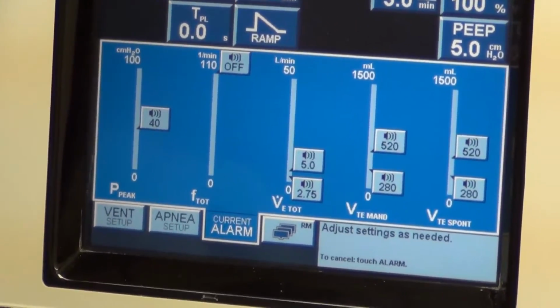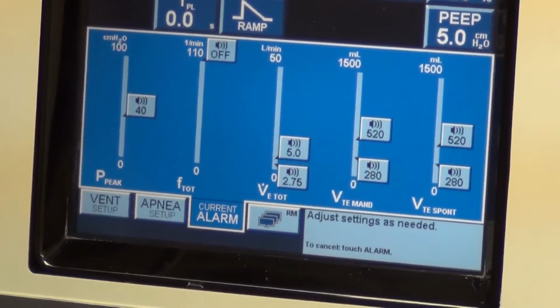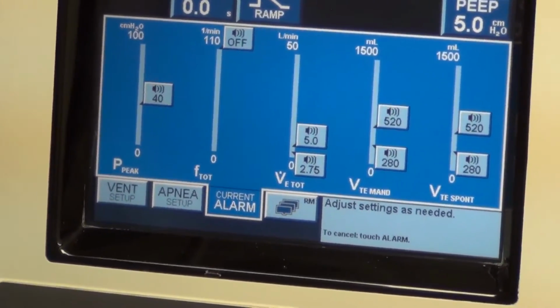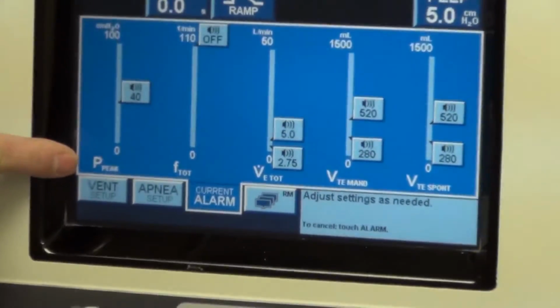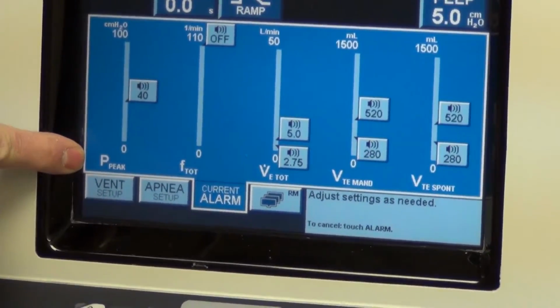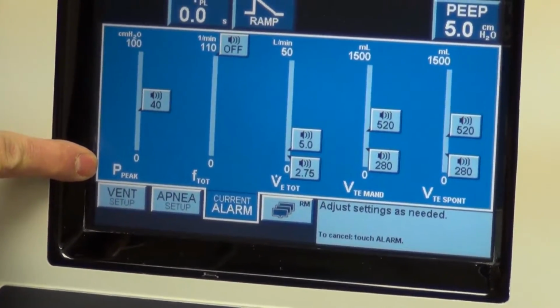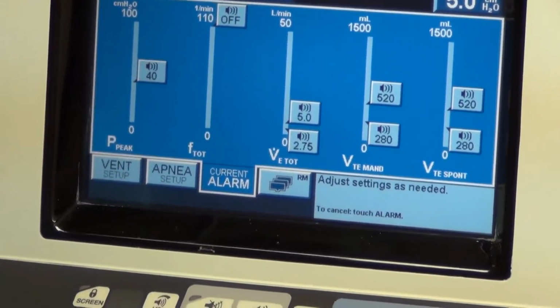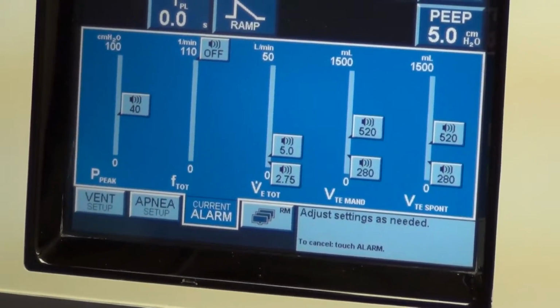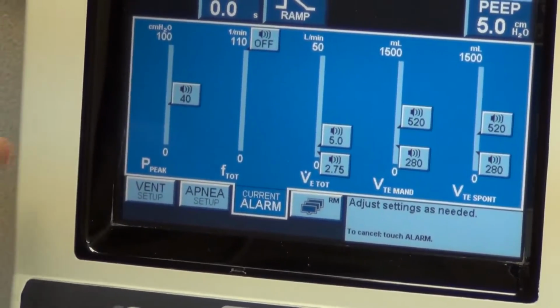Next, we go to the alarm settings. This is basically if something goes wrong, the machine will alarm and let us know that something is happening. The first column here for the alarm is peak pressure. Peak pressure is just, for instance, if something is obstructing the tubing, or the patient's coughing, or he has a mucus plug, the peak pressure alarm will go off.